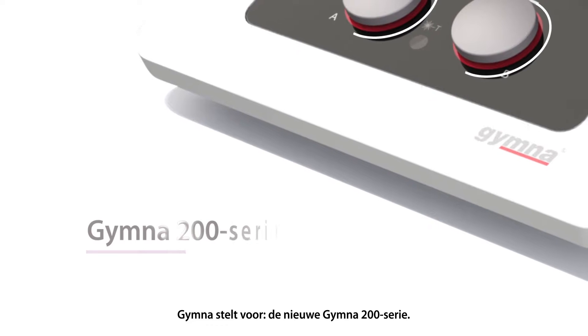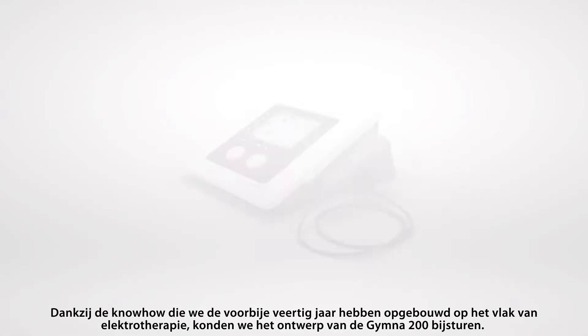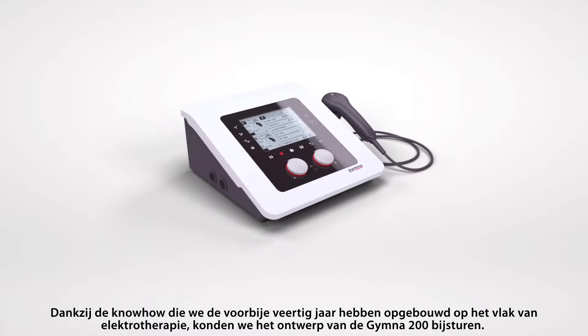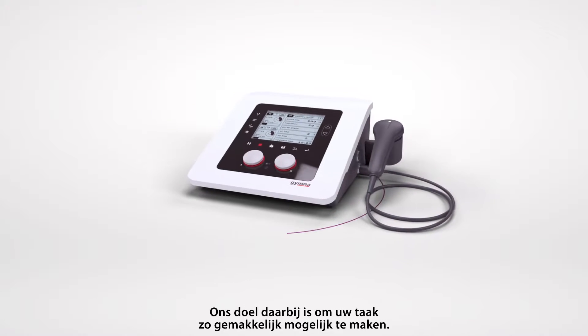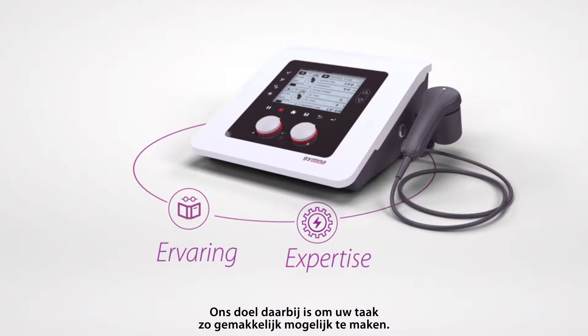GYMNA presents the new GYMNA 200 series. The expertise gathered through 40 years of experience in electrotherapy enabled us to redesign the GYMNA 200, fully focused on making your job as easy as possible.